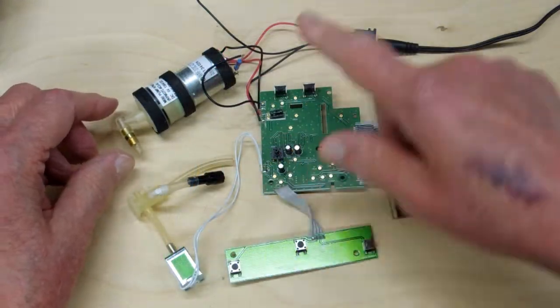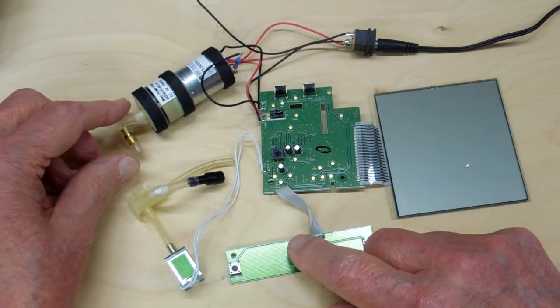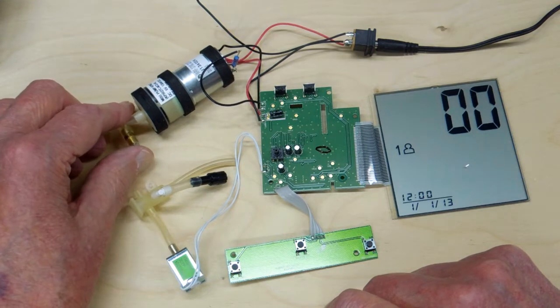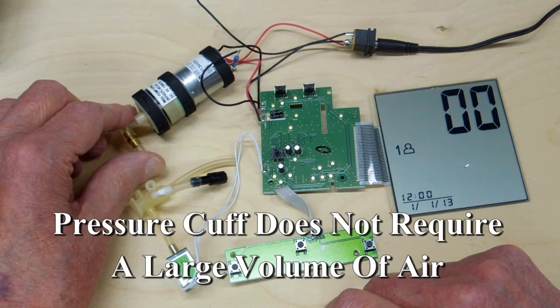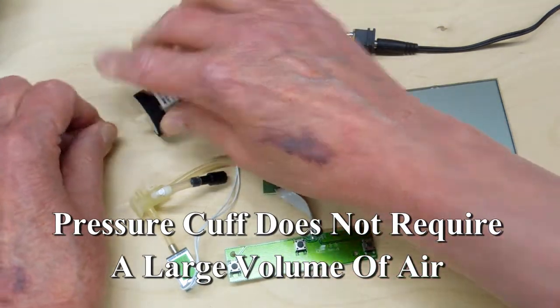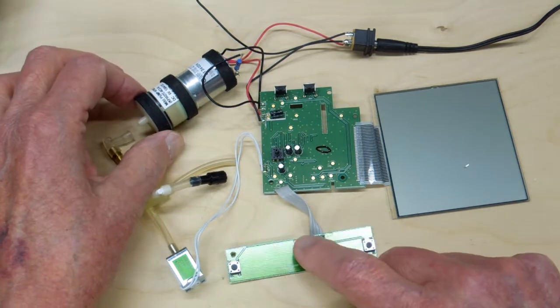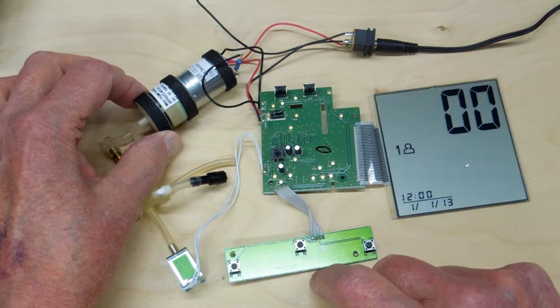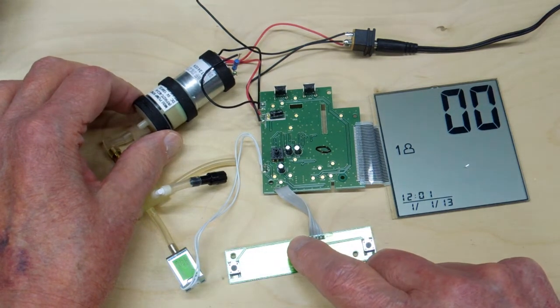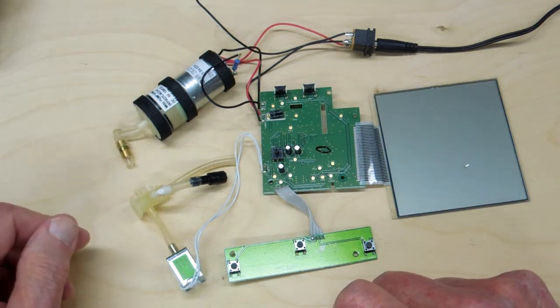I've disconnected everything from the pump. That little choke is still in here — we'll run that for a second. There's not much air coming out of there. Now we'll run the pump without that little choke in there. It runs quite a bit faster without the back pressure on the pump.